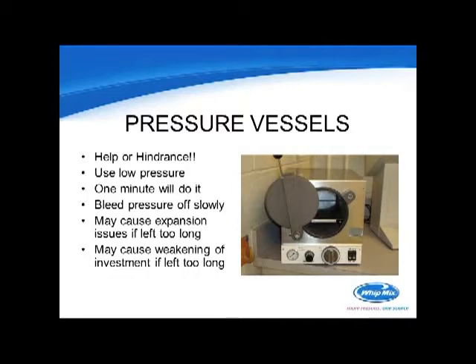You may have problems with expansion if you're putting them in these pressure vessels and then leaving them under pressure while the material is trying to set, because you have two opposing forces. You have the expansion that's trying to take place because of a chemical reaction, and now you have the pressure from the vessel trying to contain it. So if you're having those problems, just using it for a minute, long enough to get rid of bubbles, not long enough for the investment to harden, will take care of some of those problems. It also can cause weakening of the investment. If it's left in there too long, that constant pressure can break down the binders that hook the molecules together, and you could have weaker investment. So take care when you're using pressure vessels.